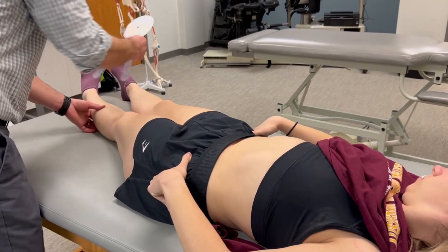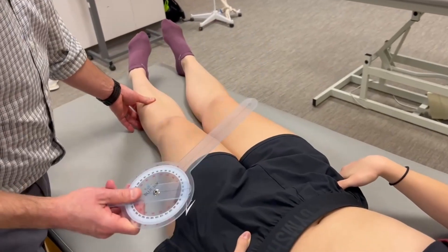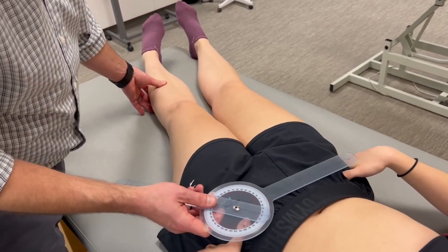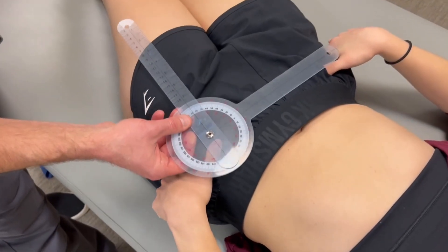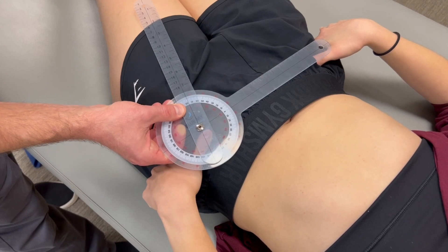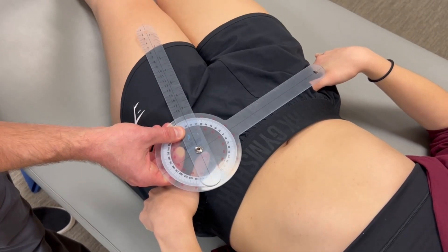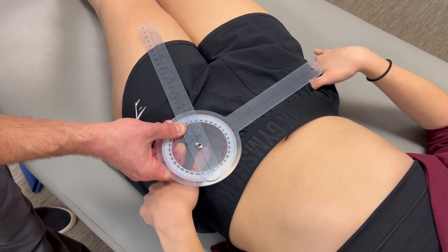We're going to maintain that end range position. Since the pelvis did depress on this side, we allowed that substitution to occur, and we're going to account for that by changing the alignment of the reference arm of the goniometer. Our distal moving or indicator arm is going to be parallel with the thigh or the midline of the femur.